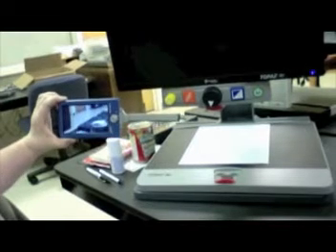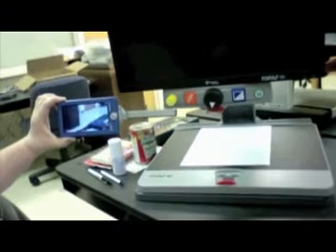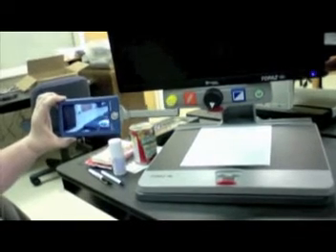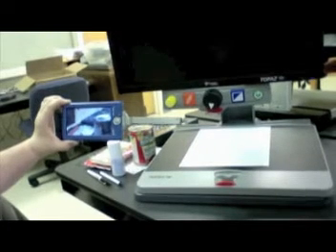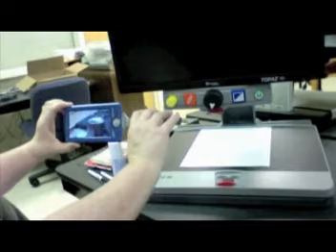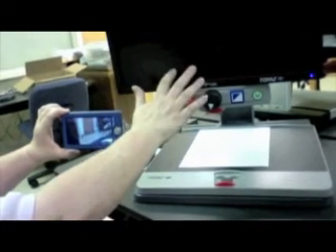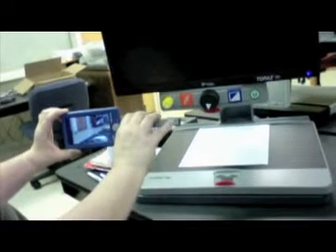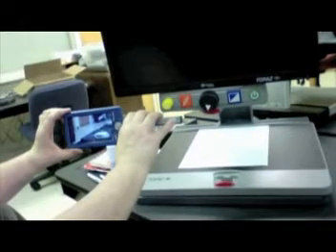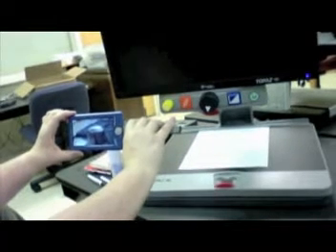This is great, though, for taking to the grocery store, if you're going shopping and want to know the price of something or the fabric content. You don't want to get something home and find out that it has to be hand washed, you know, those kinds of things. These more and more are devices that don't replace a traditional unit like this, but a lot of people find them very helpful for their daily living. You can set a thermostat. You can get up close on your thermostat to set it. Different things like that.